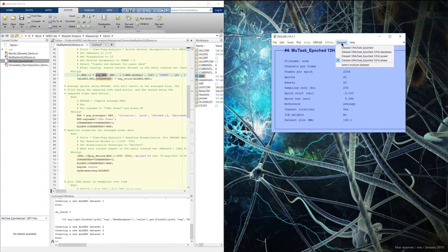We should baseline normalize this to decibels before plotting. The ERPLAB baseline normalization techniques are not appropriate for data in these units, so we have a baseline normalization tool in the time frequency analysis package. Going to Baseline Normalization for ERPLAB data, we select a baseline window — I'll use negative 1500 to negative 500 milliseconds — and then choose a normalization technique. There are presets for decibel, percent change, and Z-transform, all showing the actual formula. We can also type a custom normalization using standard MATLAB notation with variables 'activity' and 'baseline'.